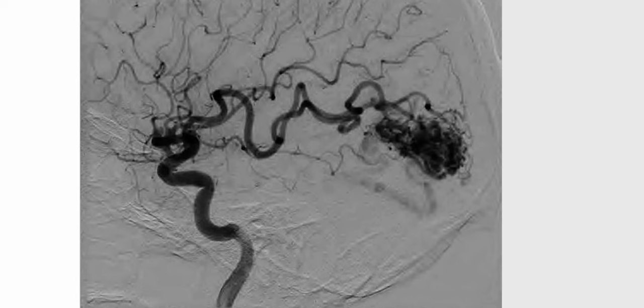So, another case of a 40-year-old man presenting with headaches. So this is a lateral DSA of an internal carotid artery injection. Again, here it is during the late arterial phase, and it shows a large hypervascular mass in the occipital region, which is supplied by the enlarged arterial feeders. And there's early venous drainage as well along the inferior aspect of the mass, which is consistent with arteriovenous shunting.